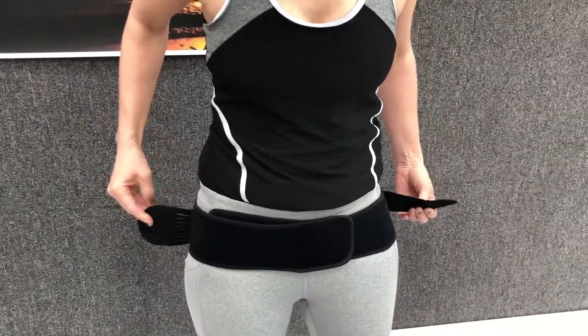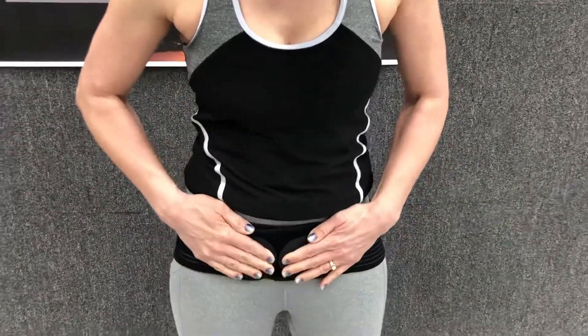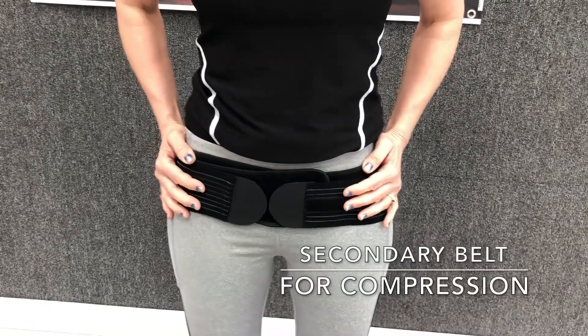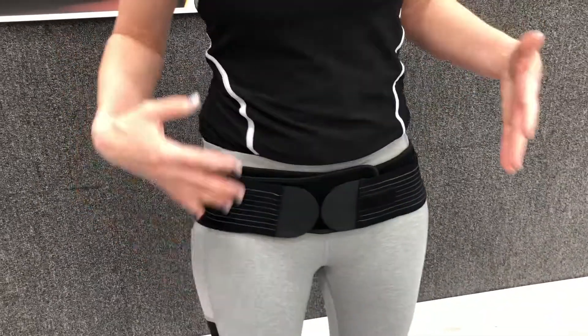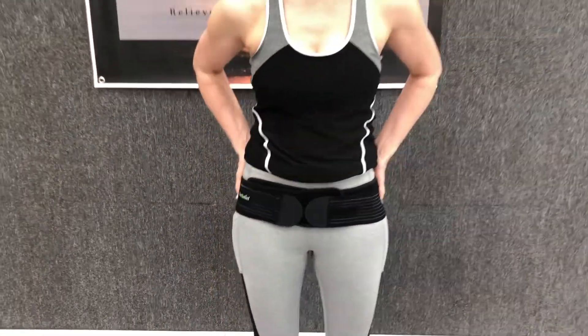The secondary belt velcros and it provides compression so that you have a nice, comfortable, tight feeling there. It's going to keep your hips from those movements that are going to create nerve issues or sciatic issues down your leg and low back pain.